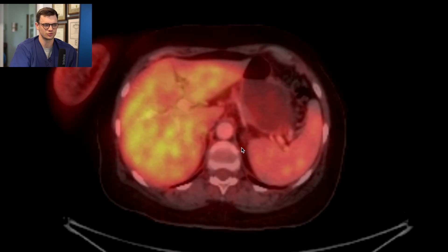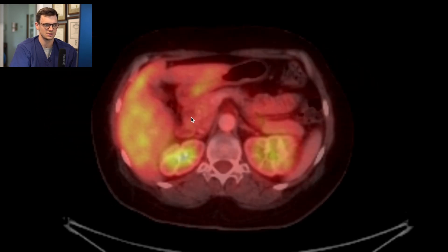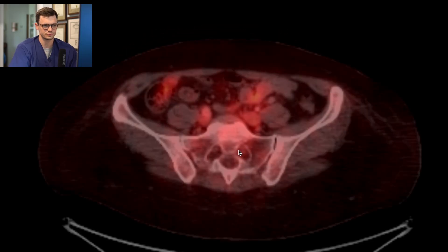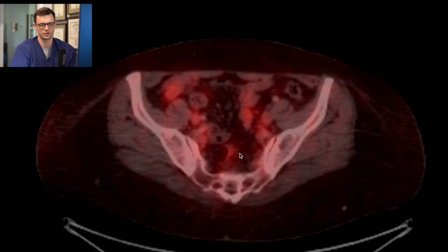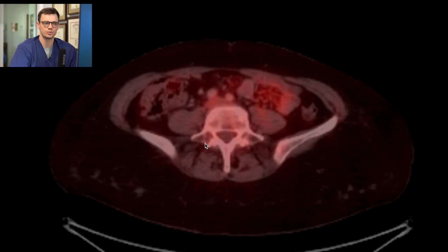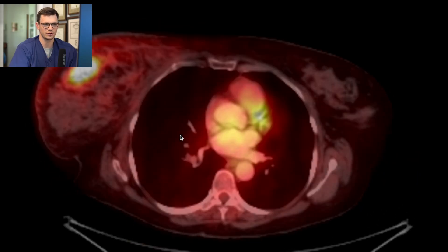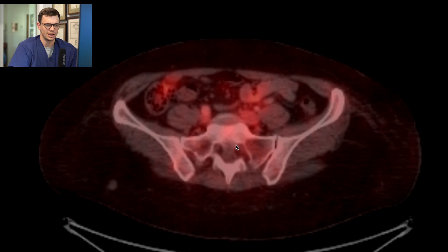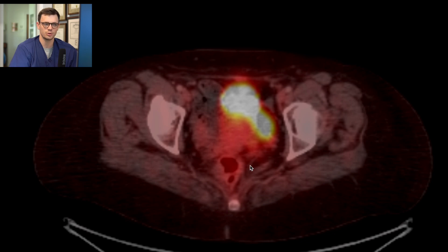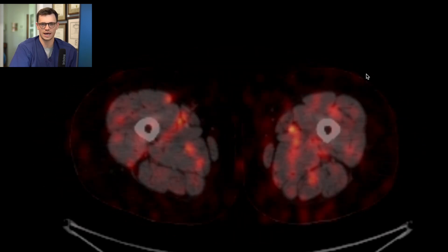Going through spleen, adrenals, pancreas, and gallbladder. Kidneys look okay on the axials; ideally I'd go to the coronals too. Tracking the bowel — going a little quicker than normal for efficiency, but the bowel looks okay. I don't see any suspicious lymph nodes within the abdomen or pelvis. We obviously have our axillary nodes, but I'm not seeing any here. Nothing really inferiorly in the pelvis. For women, always take a look at the adnexa — make sure the ovaries, if postmenopausal, aren't super hot, as that can be evidence of an ovarian tumor. Now let's look at the bones. Breast cancer goes to the bones — it usually produces osteoblastic metastases that show up as sclerotic, though some malignancies produce lytic lesions. Either way, they'll show up as hot.